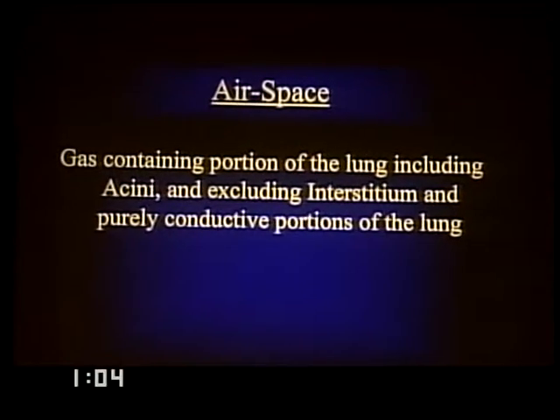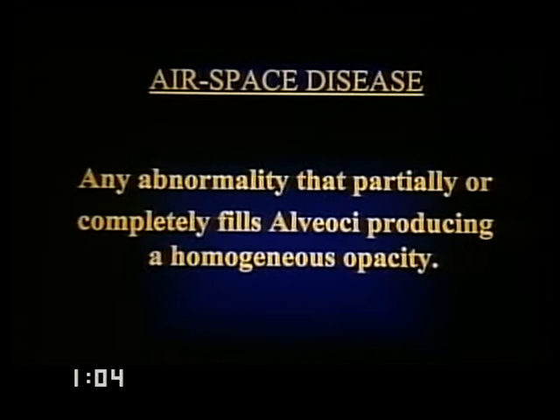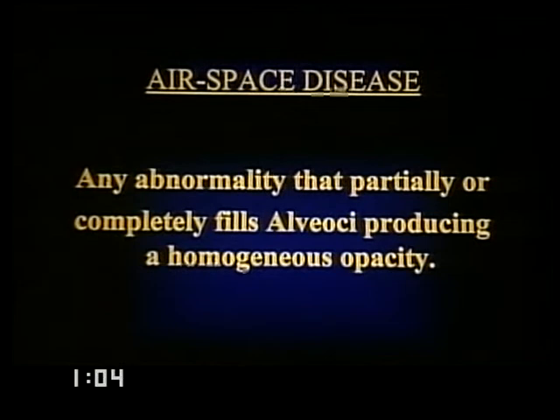By definition, the airspace is that portion of the lung which contains gas and excludes the interstitium and the purely conducting portion, that is the bronchi. An airspace abnormality is anything that replaces the air within the alveoli, filling the alveoli to a greater or lesser extent and producing a more or less homogeneous opacity.